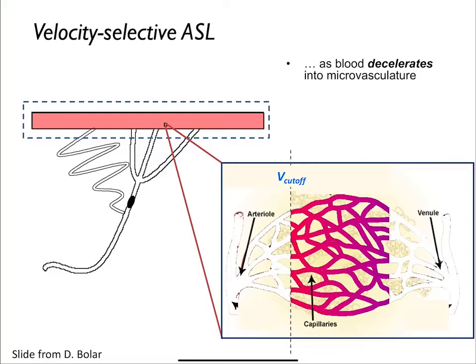Okay? And the idea here is, as we talked about, we're tagging very close to the brain tissue. We're at the 100 micron diameter arterioles, so we don't have to worry about this transit delay. We're tagging blood wherever it is, wherever it's moving slowly. And so that allows almost immediate delivery, and so in theory, gets around these transit delays.